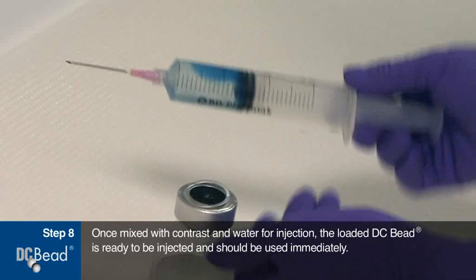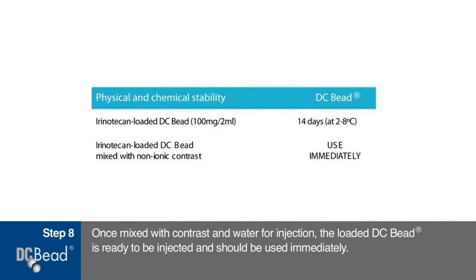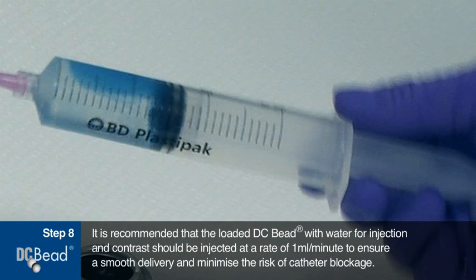Once mixed with the non-ionic contrast and water for injection, the loaded DC bead is ready to be injected by the interventional radiologist and should be used immediately. Immediately prior to use, each syringe containing loaded DC bead mixed with water for injection and non-ionic contrast should be gently agitated to create a stable suspension for injection. It is recommended that the loaded DC bead be injected at a rate of 1 milliliter per minute in order to ensure a smooth delivery and minimize the risk of catheter blocking.